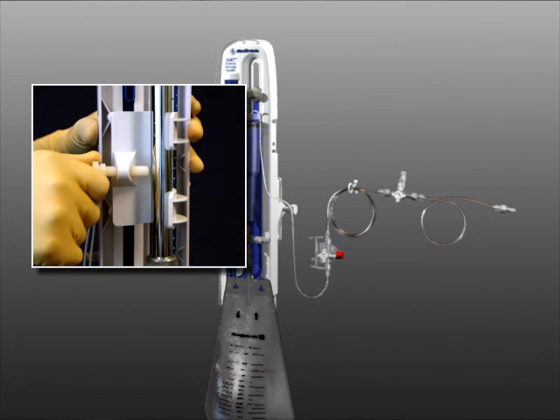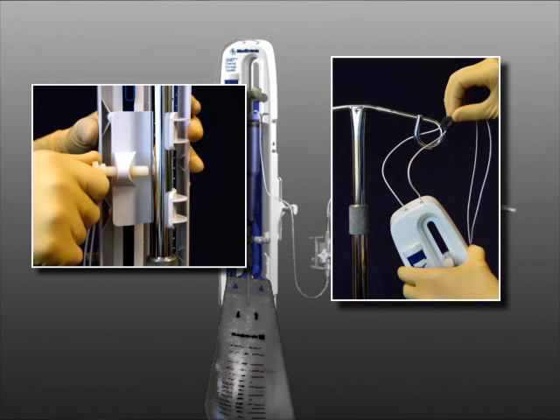The DUET can either be attached to an IV pole utilizing the built-in pole clamp or hung by the cord and cord lock located at the top of the system.